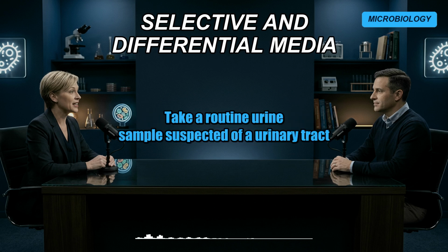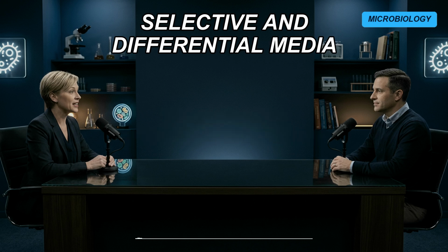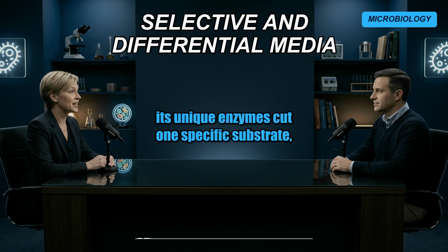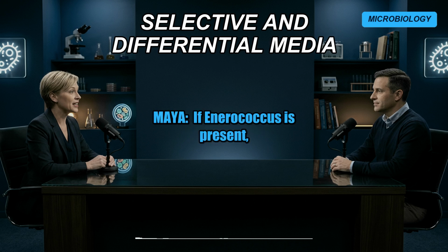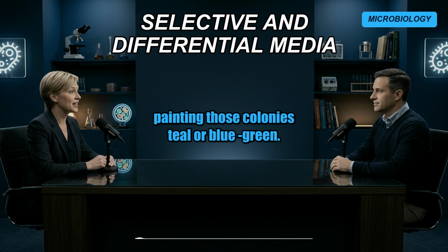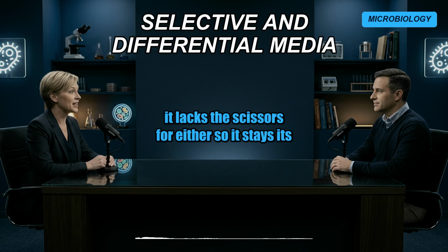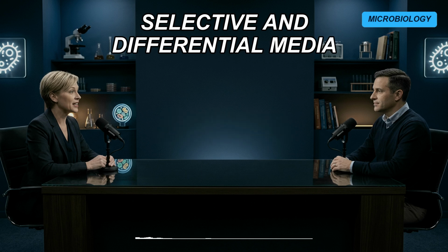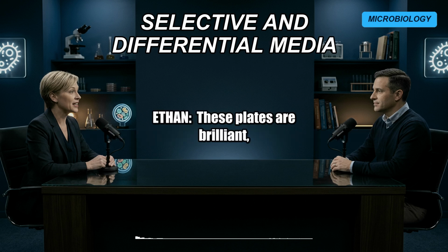staggering. Take a routine urine sample suspected of a urinary tract infection. A lab can spread that sample on a single chromogenic plate. If E. coli is present, its unique enzymes cut one specific substrate, painting its colonies bright pink. Wow. If Enterococcus is present, its enzymes cut a different substrate, painting those colonies teal or blue-green. If Proteus is present, it lacks the scissors for either, so it stays its natural beige color. You get immediate, unambiguous visual identification of multiple pathogens on one piece of jelly. These plates are brilliant, they're relatively inexpensive, and they're incredibly fast.